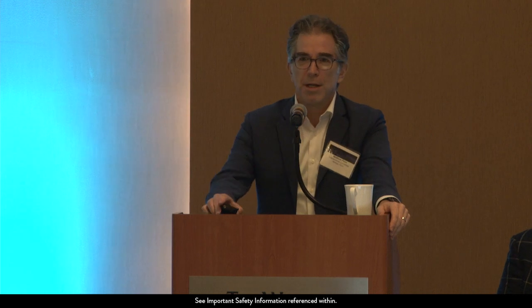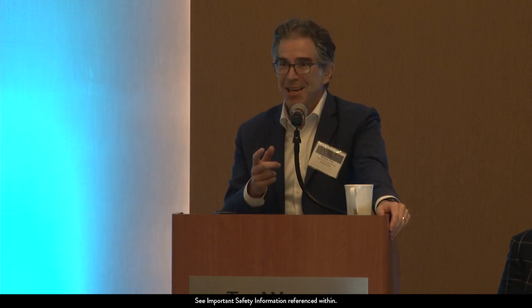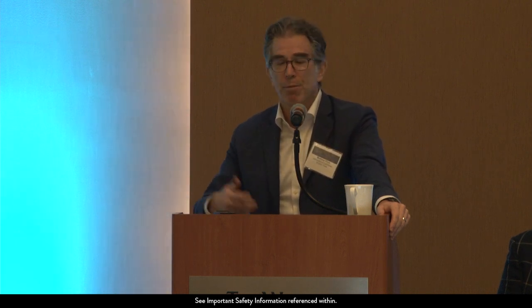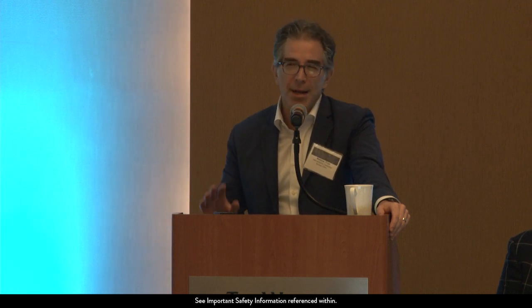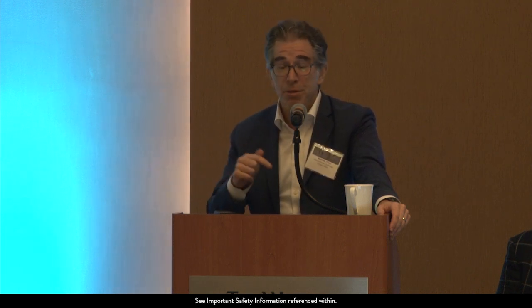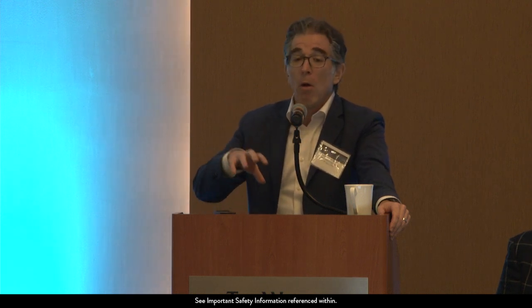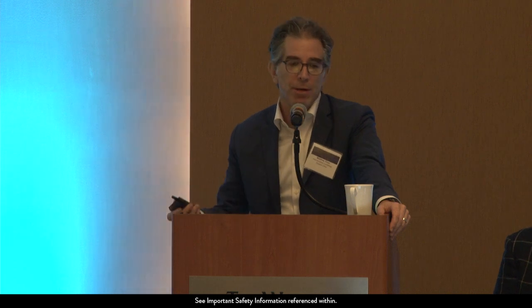You have to admit the patient, maybe they aspirated, and so forth. And really, I think the actual thing that caused our switch was COVID, where the TEE docs didn't want to do TEEs. We have anesthesiologists where we do TEEs. They give propofol, and the anesthesiologists didn't want to do TEEs. So I had to change my thinking cap a bit. And that changed it, in combination, and we'll talk about this with 3D ICE. I'm going to talk a little bit about what I do now for pre-planning and what I think is the vision for the future for LAO in general and for all of us here in this room.